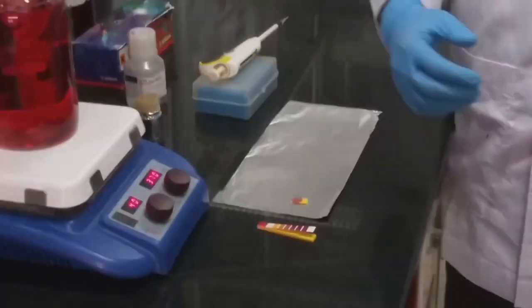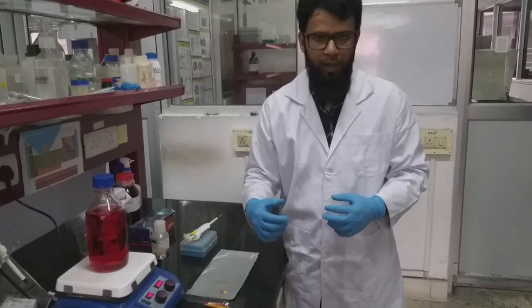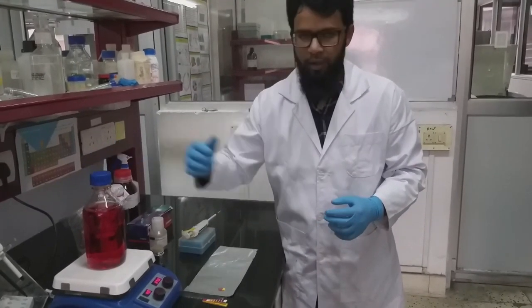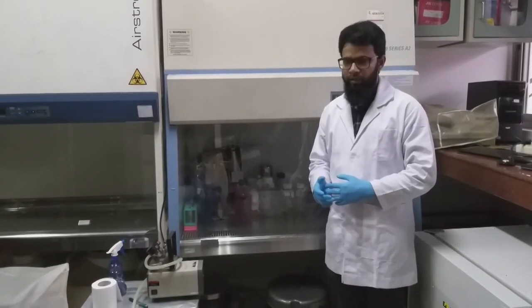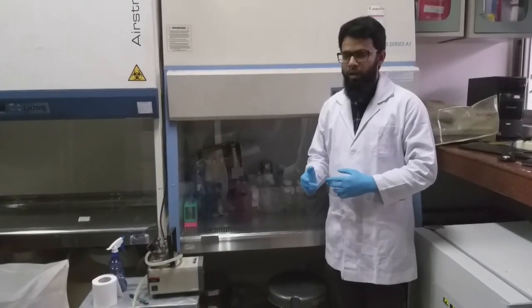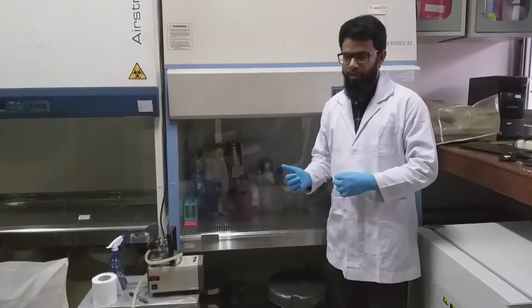After the media has been set, we now need to filter the media inside the biosafety cabinet, as we have added the constituents in non-aseptic conditions. After the media components have been completely dissolved and the pH has been set, we now need to sterilize the media using membrane filtration.